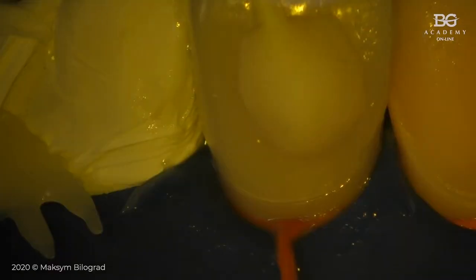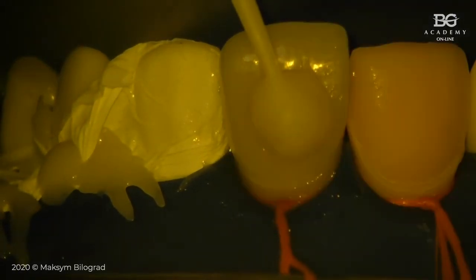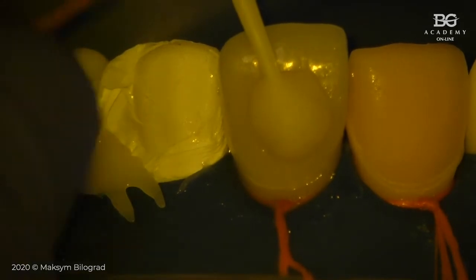From the area of lateral incisor, what I can do, I can take my floss, because still I can have some excess of material between teeth, but it's not a problem because we can take floss. We can go between teeth with a floss and clean the interproximal area with floss. Then, what do we do then?